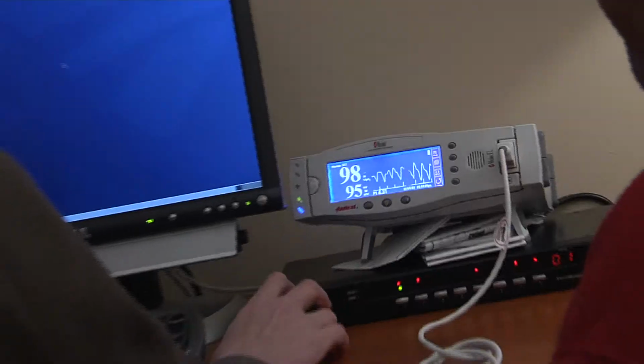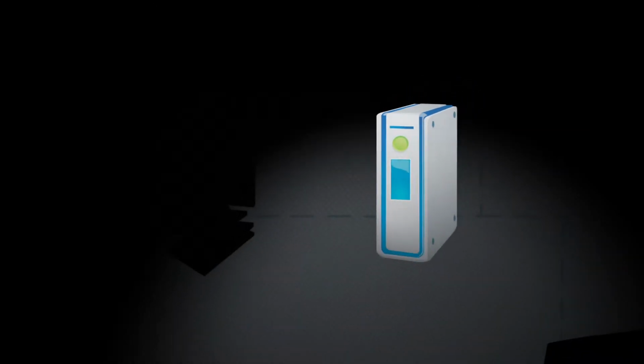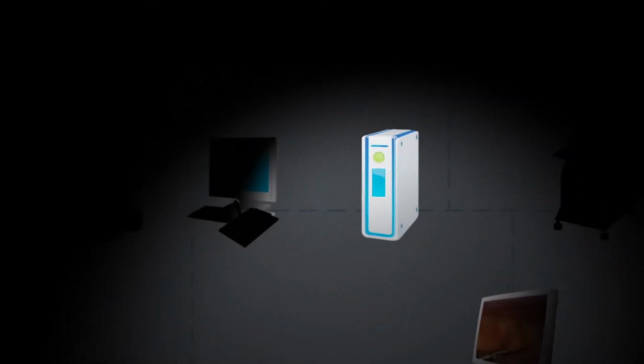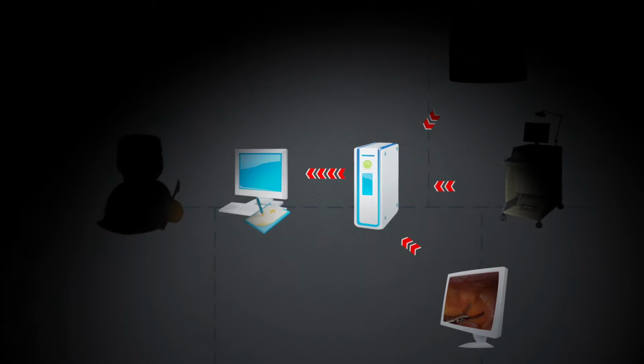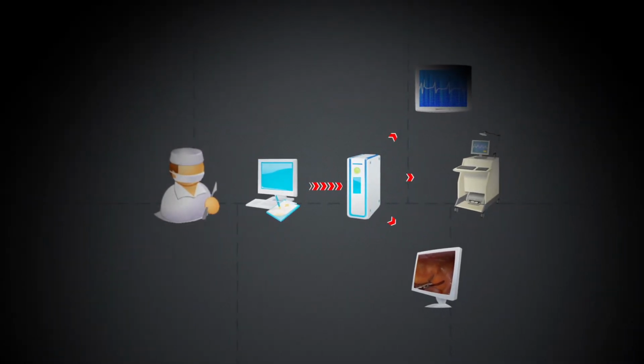As technology projects go, the unique things are the focus on the evaluation of the technology in the hands of experienced practitioners, and the idea of integrating technologies in a way that actually helps the practitioners instead of just adding more devices to their little islands of technology. The idea of a plug-and-play environment makes each of the systems required to do a surgery aware of each other and defines a protocol for those systems to communicate with each other.